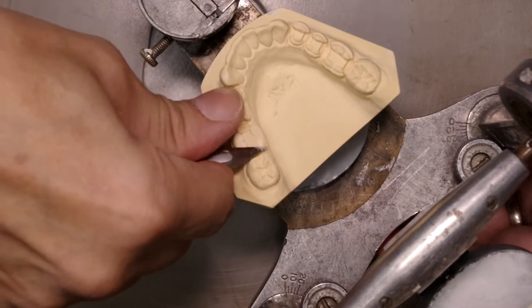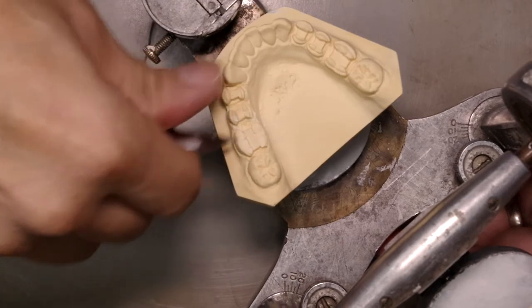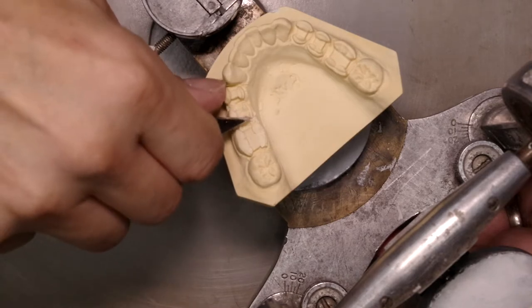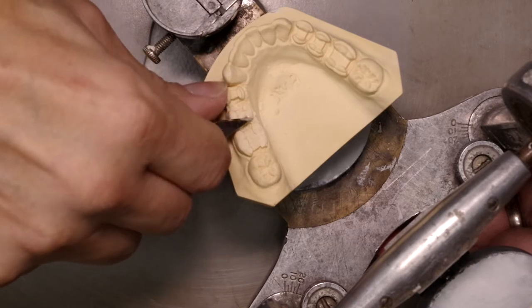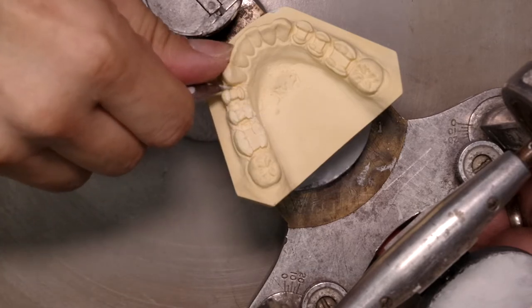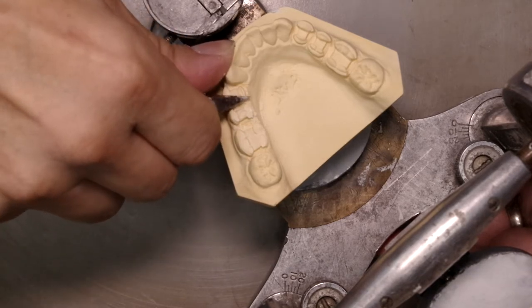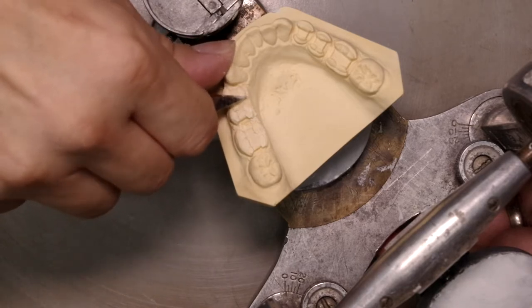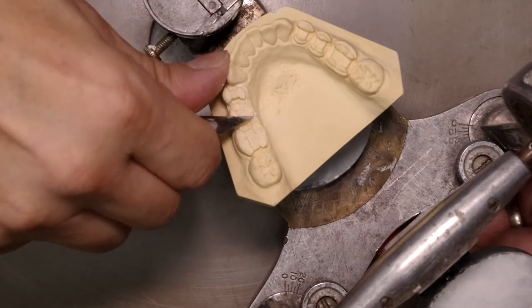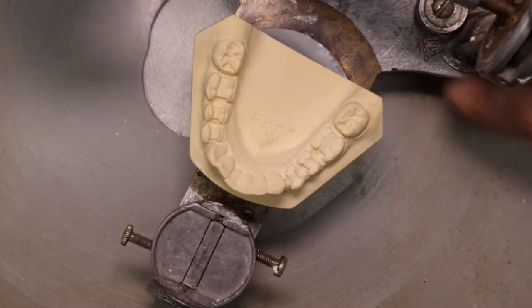But only the tips. We will make them fairly flat so that this will give us enough room to make our little cones, so that we can aim the cusp tips right where they need to be. If we do this to both sides, we should have a minimum of 3mm between the preparations.